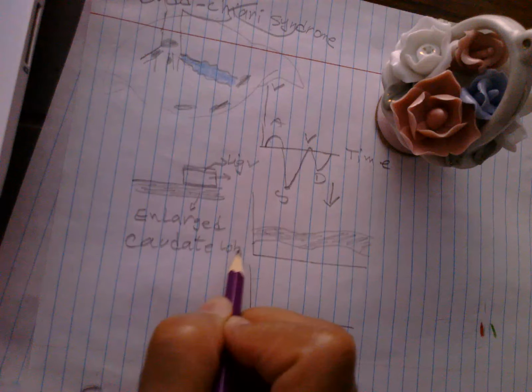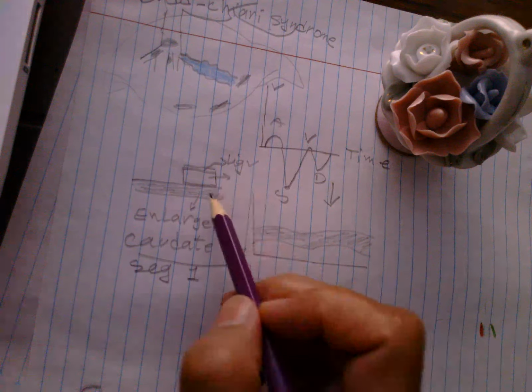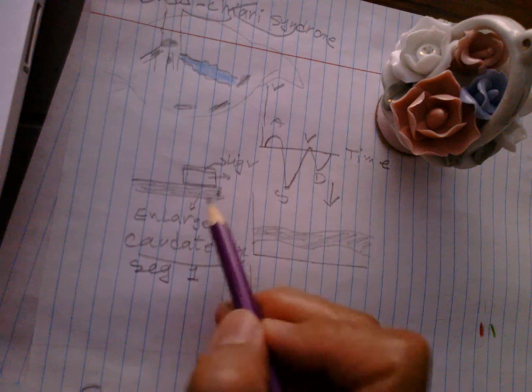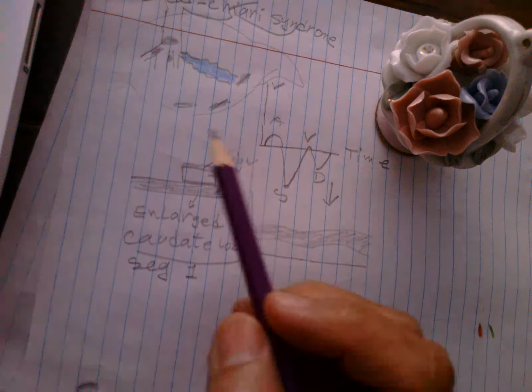The caudate lobe is the first segment, segment one, in the left lobe of the liver, anterior to the IVC, a little posterior. It is in the posterior part and above the pancreas.